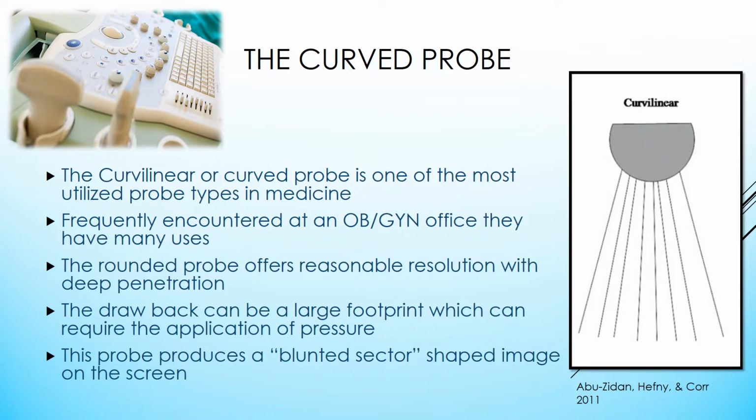The curvilinear probe or curved probe is one of the most utilized probe types in medicine. Frequently encountered at the OB/GYN office, they have many uses. The rounded probe offers reasonable resolution with deep penetration. The drawback can be a large footprint which can require the application of pressure.